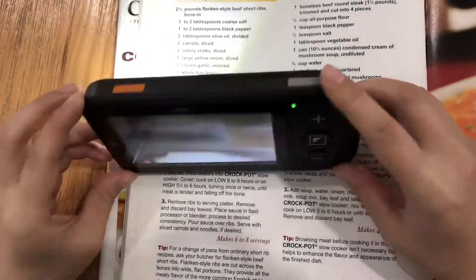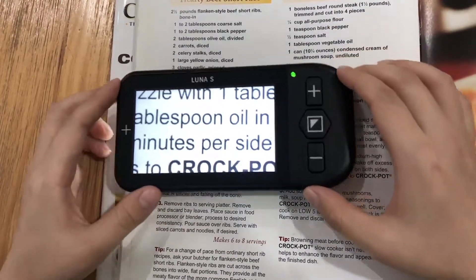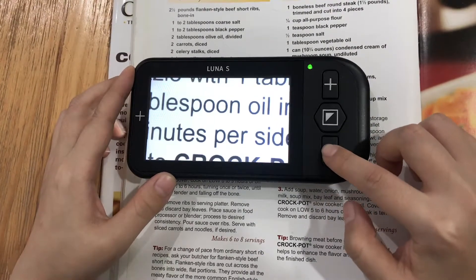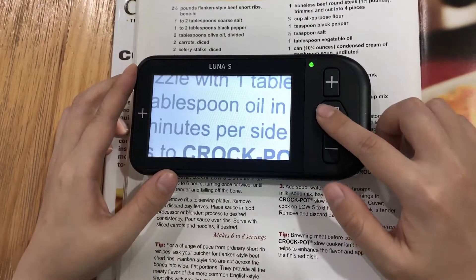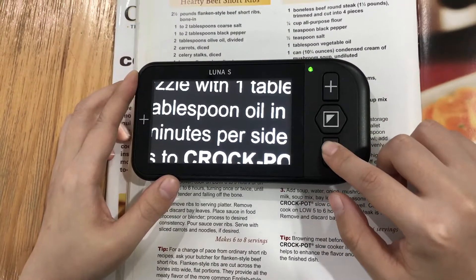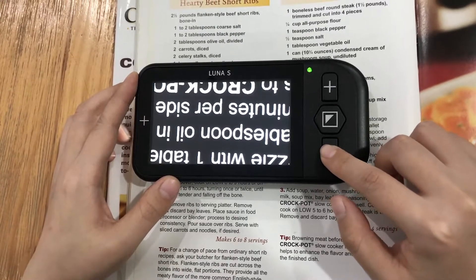Press the freeze button to freeze the image. Press the zoom in or zoom out button to change the magnification, and the mode button to change the color. Press and hold the zoom out button for 2 seconds and the image will rotate 180 degrees.